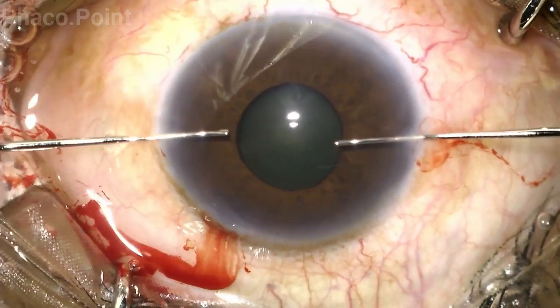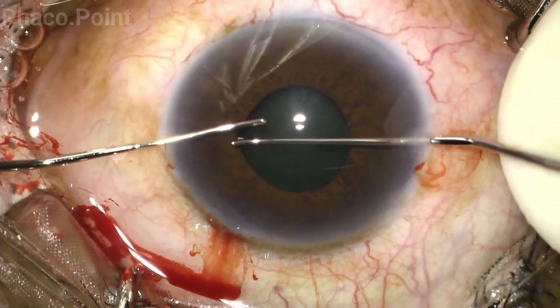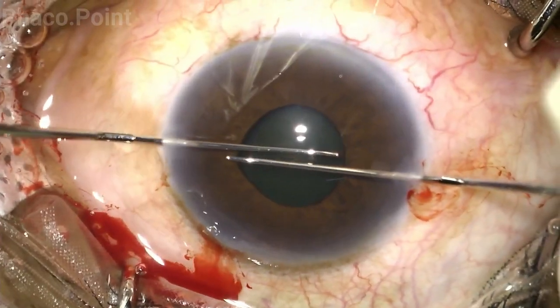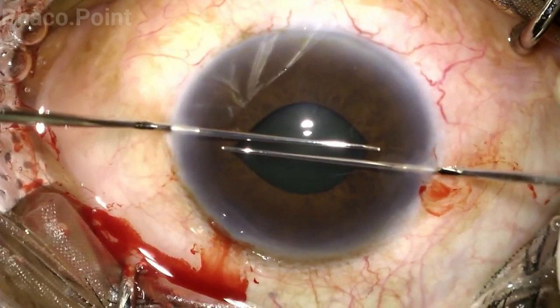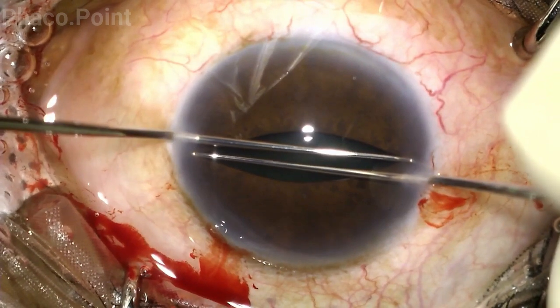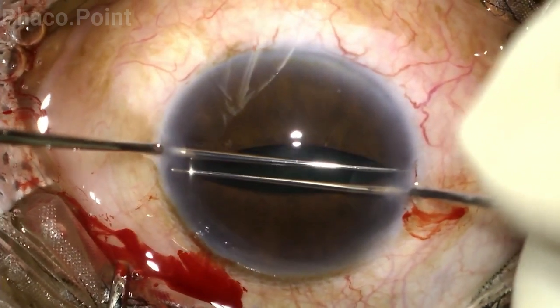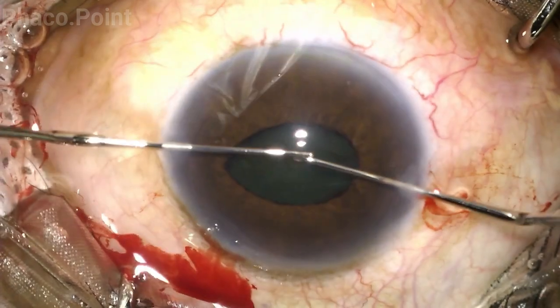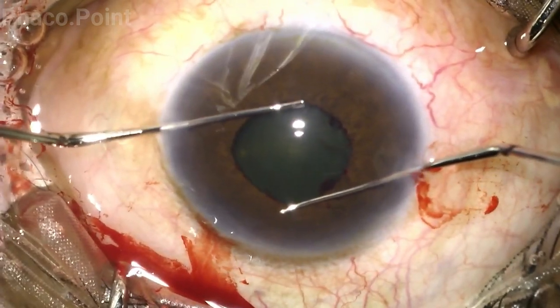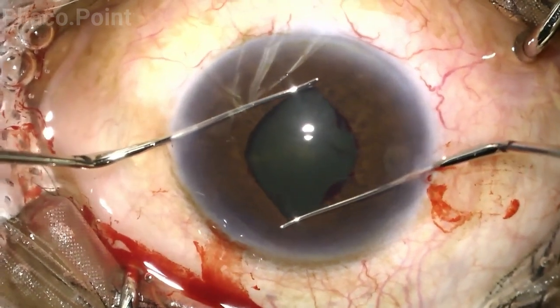Under viscoelastic, both hooks are introduced and turn by turn each of the pupillary edges in the horizontal plane are hooked. In a controlled manner, both hooks are pushed to the opposite limbus. This results in a tear of the pupillary edge and results in pupillary dilatation. To augment this effect, the same technique is repeated but this time in the vertical meridian.